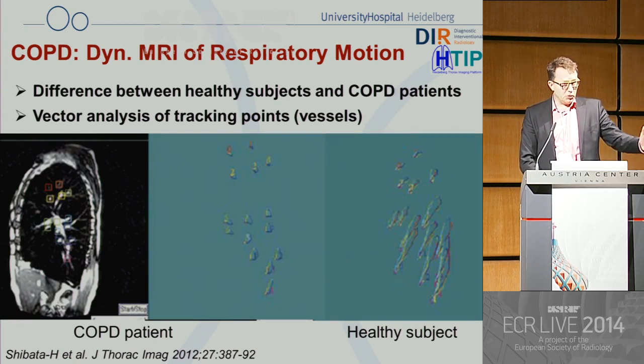What is also important is to look for dynamic MR during breathing for COPD, and you will see certainly the effects of hyperinflation and air trapping, that the motion here at different landmarks within the COPD patient is much, much less than in a healthy subject.